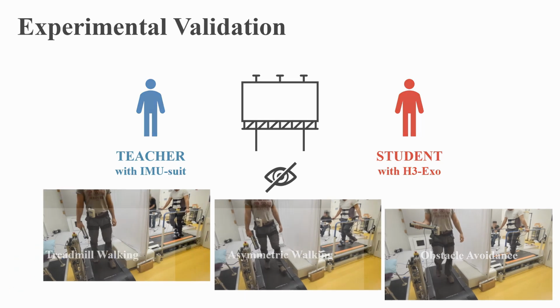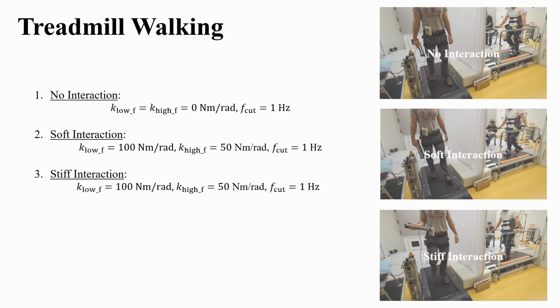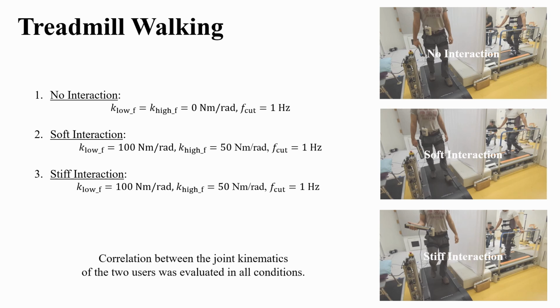each other. In the first scenario, we tested the effect of the virtual connection stiffness on teacher-student interaction during natural walking. The 2 users were asked to walk at 1.1 kilometers per hour, while 3 interaction impedances were applied to the exoskeleton controller: no interaction, soft interaction, and stiff interaction. We hypothesized that stiffer connections would more closely align the joint configurations of the student and teacher. For this reason, the correlation between the joint kinematics of the 2 users was evaluated in all conditions.